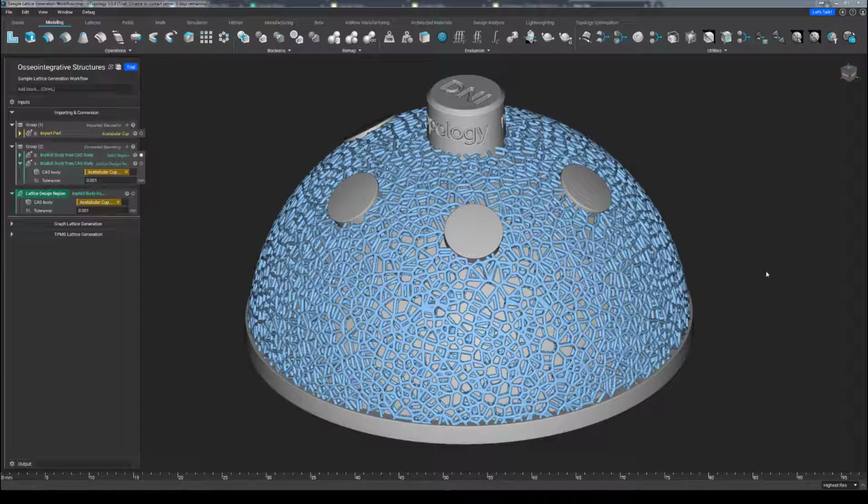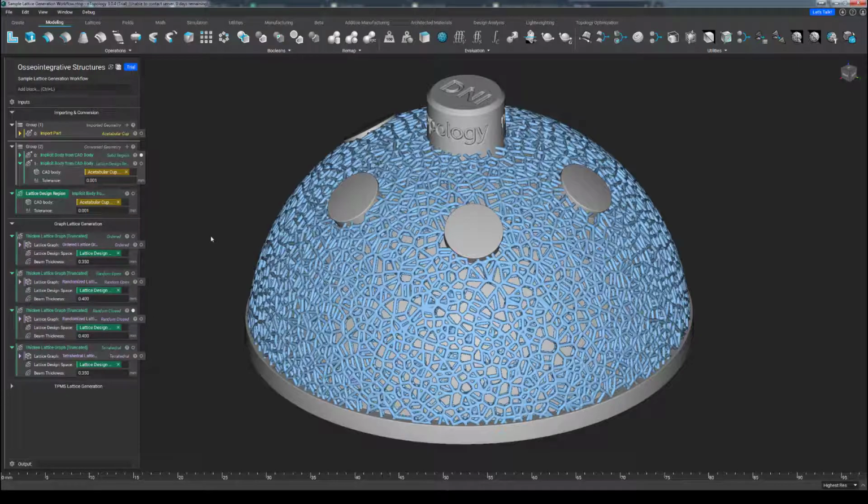Today's focus is on the lattice structure generation aspect of this osseointegrative structures toolkit. I have here a few different lattice structures already created, using blocks from within the lattice graph generation folder and the structure generation folder of the downloadable osseointegrative structures toolkit.